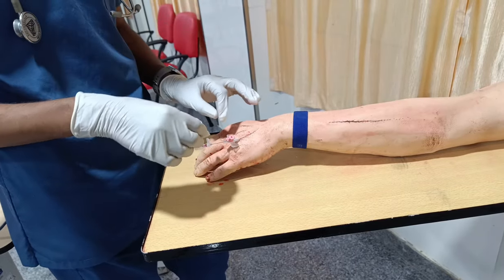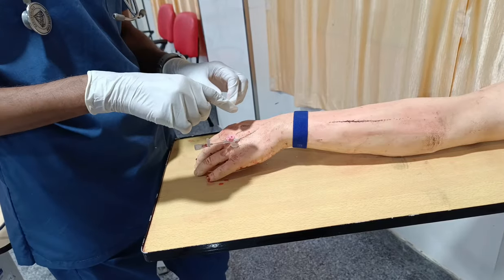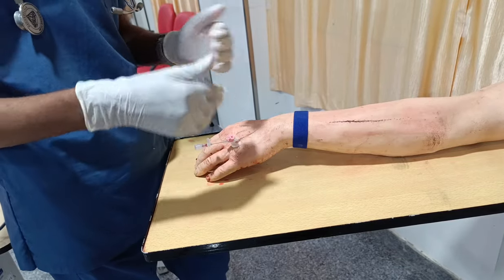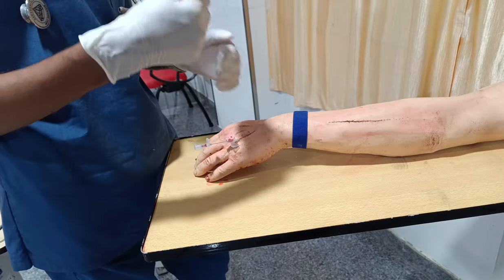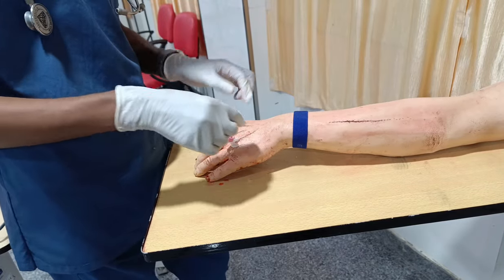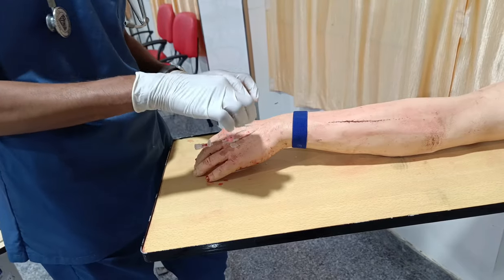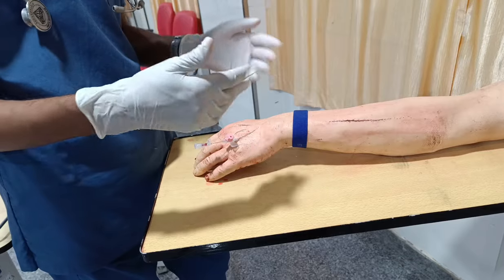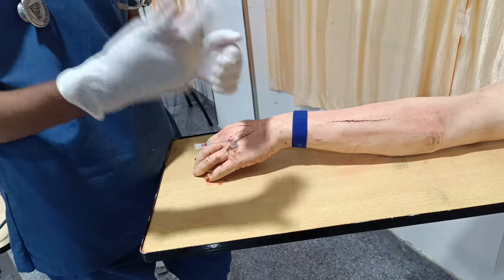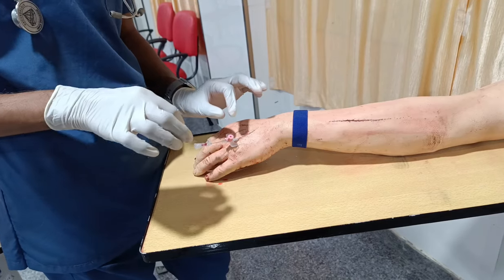If you are progressing along with the needle, there might be a chance of re-pricking of the vein, or a counter puncture of the vein can happen. But if you are partly withdrawing the needle and only introducing the plastic portion, it won't damage any other vessels, or cause any counter puncture. That is why you have to partly withdraw the needle.